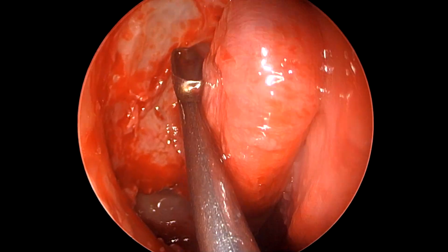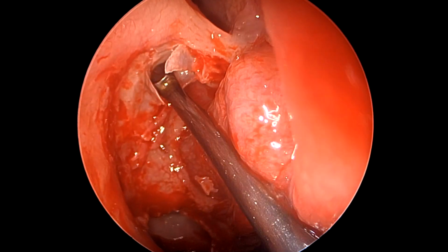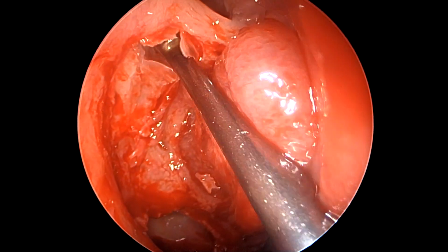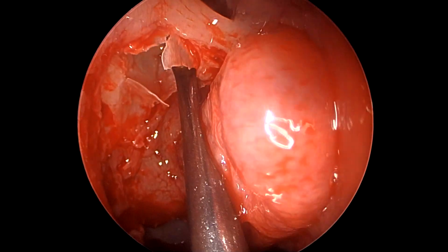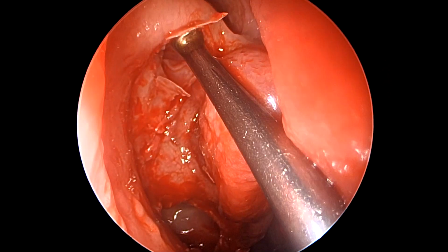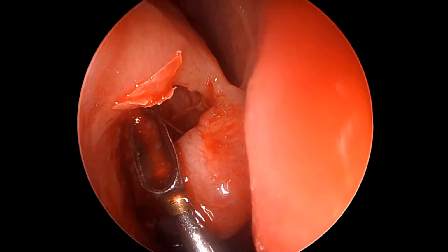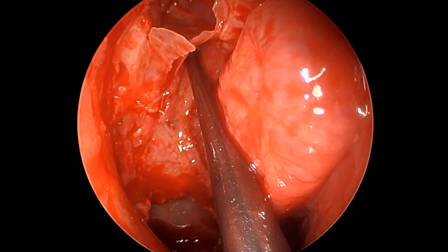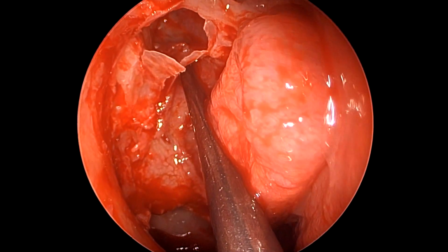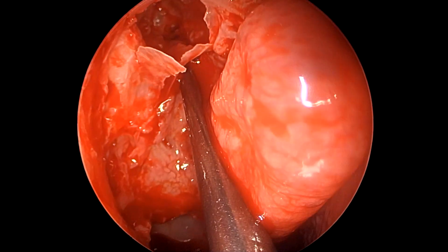As we see here, once the antrostomy has been done, we are trying to negotiate our way with the bulla still intact inside to find and remove the posterior wall of the agger nasi, or the first cell. We have still not opened the bulla, and this could be called the intact bulla approach, though of course we would be removing the bulla because of opening the ethmoids. But we are just seeing how we can insinuate our instruments with the bulla intact and try to see what we are seeing in the frontal sinus and the frontal recess.